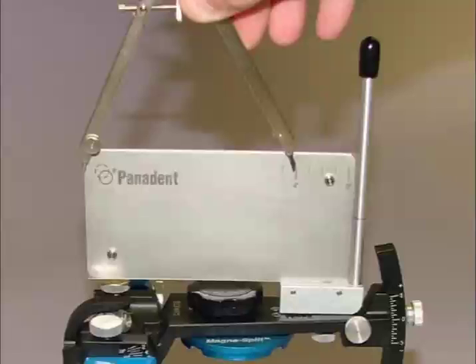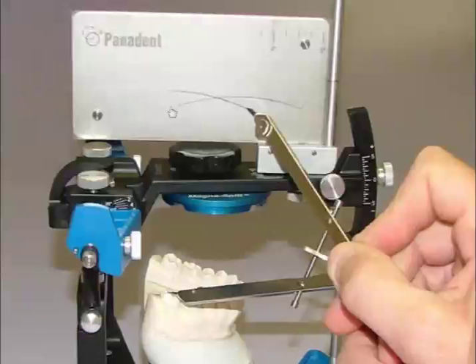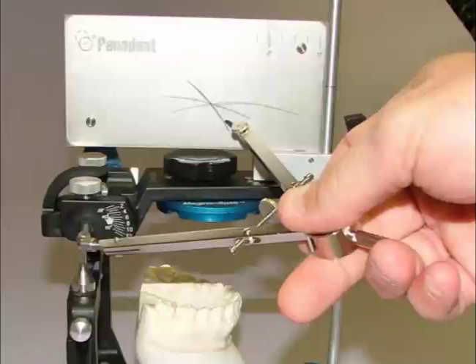It's based on Monson's spherical theory of 4 inches, so we'll set the compass at 4 inches, and we come to a canine point on the lower cast and scribe an arc here on the flag above the articulator. We'll then come to a molar point and scribe another line on the flag. If you don't have one of those 2 points, you can also come back to an axis point here and scribe a third line. Notice how all 3 lines intersect basically at the same point.